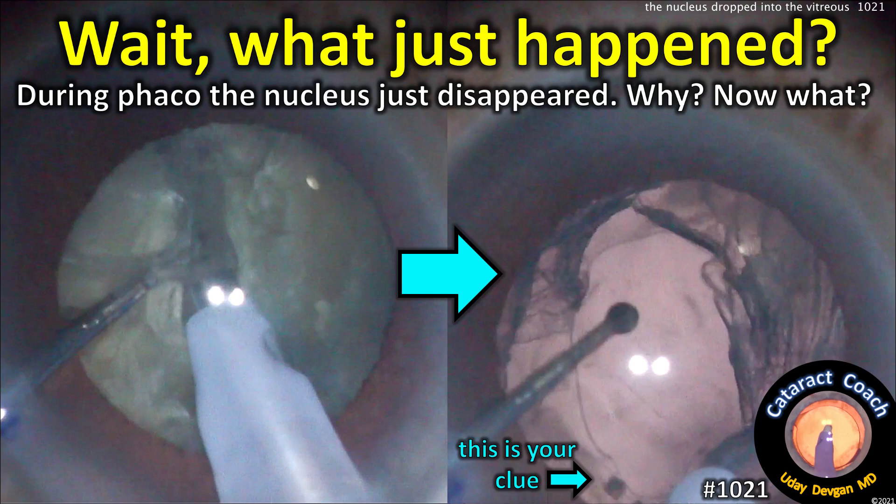CataractCoach.com. Wait, what just happened? During Faco, the nucleus just disappeared. Why?